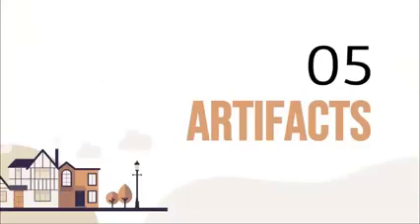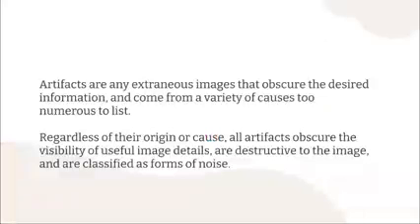Now let's go to artifacts. Okay, same as in your film screen subject. Artifacts are any extraneous images that obscure the desired information and come from a variety of causes too numerous to list. Regardless of their origin or cause, all artifacts obscure the visibility of useful image details and are destructive to the image and are classified as forms of noise. Even if the artifact looks good, it is destructive to the image. It does not contribute any information to the image. It's just a nuisance. Okay?